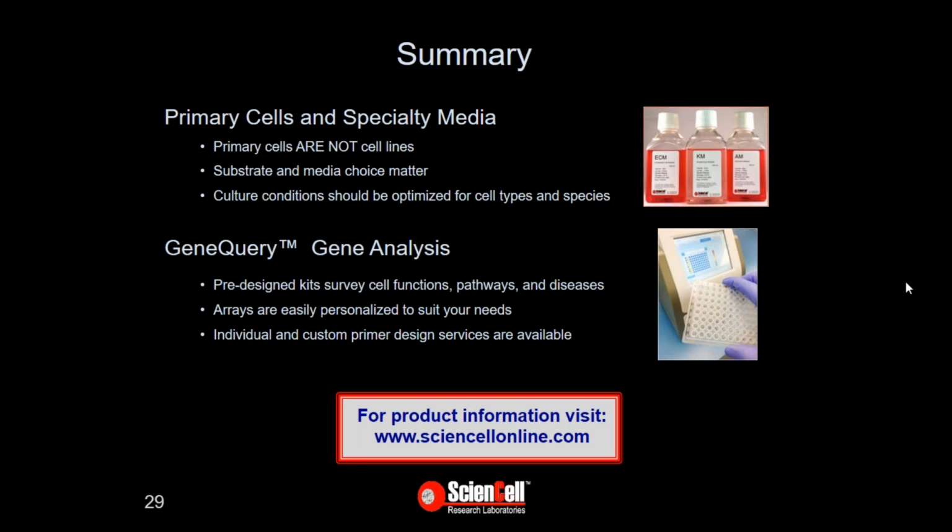Okay, so another question was, can I use my own medium or other commercially available media for culturing your primary cells? Our cells have been cultured and tested in our own medium, which we recommend for you to use. They've been adapted to our specific formula. Using other media may be fine, but it may also yield unsatisfactory growth due to the adaptation process. So it may not end horribly, but we don't really recommend that.